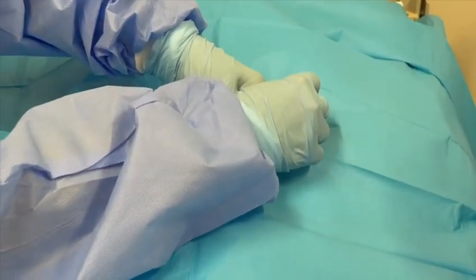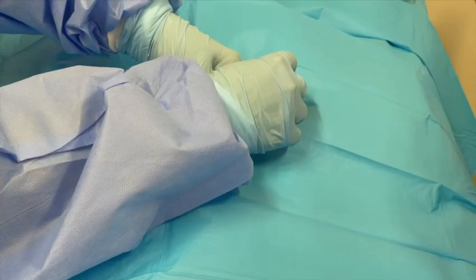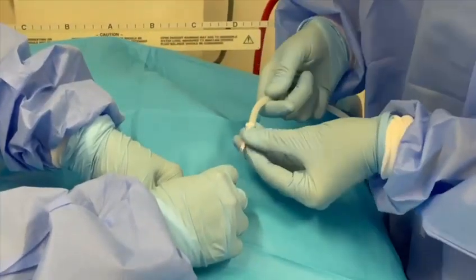Remove the syringe, occlude temporarily, then thread the guide wire through the hub of the insertion needle via the white plastic tip.